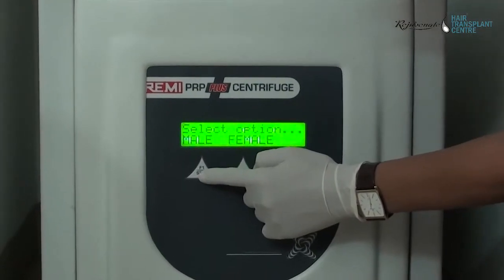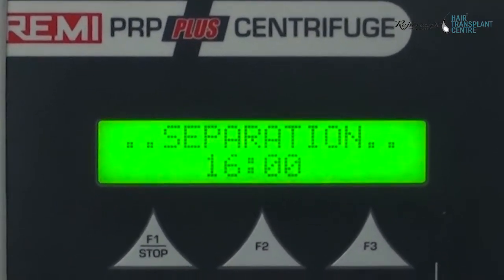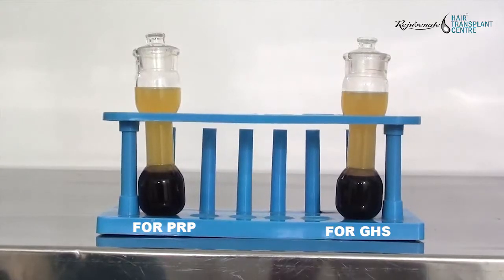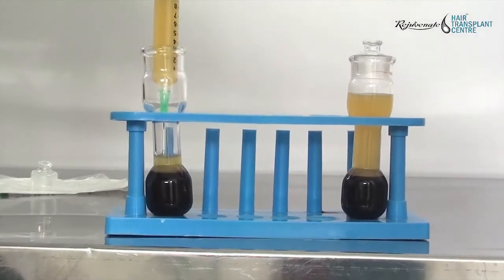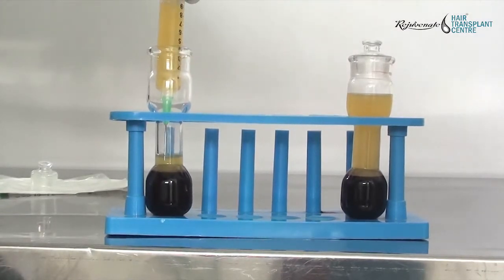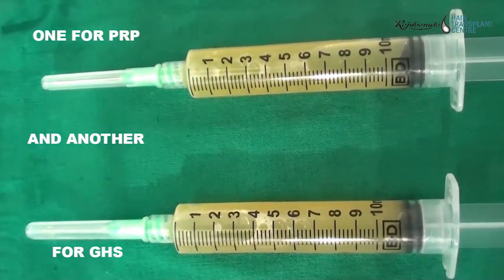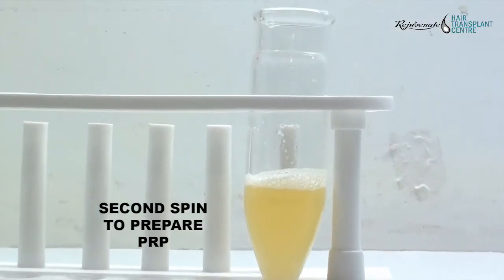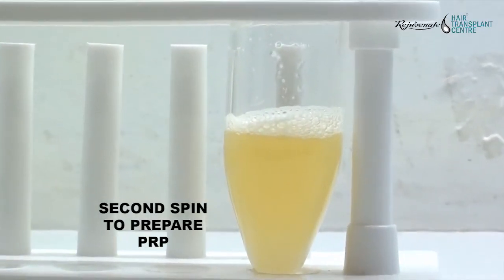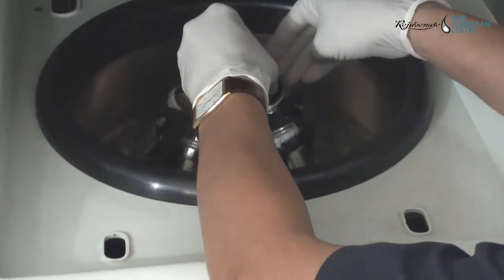The spin is performed for separation of RBC and plasma. These are the two containers with plasma now separated from the RBC. Plasma is withdrawn into syringes from both containers — one syringe to be used as graft holding solution and another for preparation of PRP, which is transferred to a glass tube.